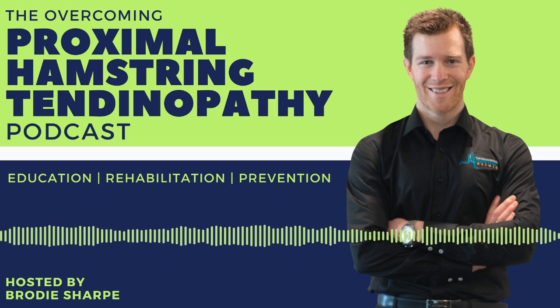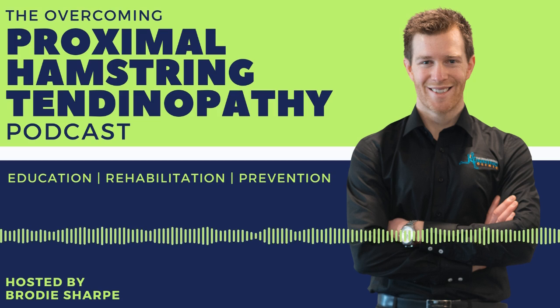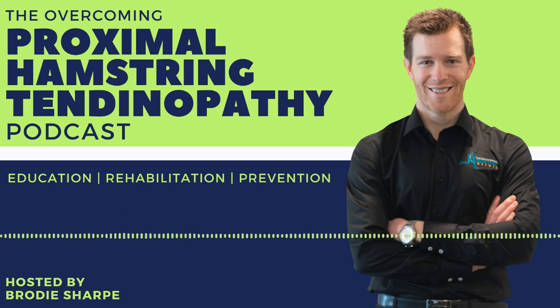So ideally, you want a patient whose symptoms are more than 3 months. Up to 2 years is okay, but once it becomes 3, 4, 5 years, I guess it's reasonable to try, but don't expect massive things to happen. You might reduce the pain by 20% or 30%. So I think you're totally right. There's that sweet spot, where you don't want it to be too chronic. But once you have symptoms for 4 or 5 years, most things don't work, isn't it?